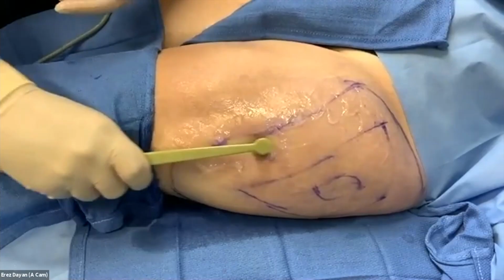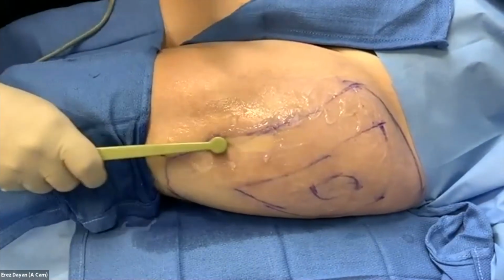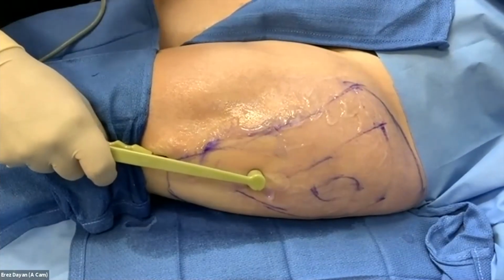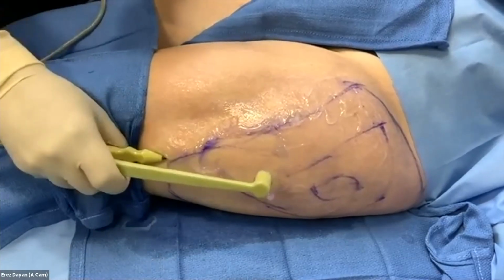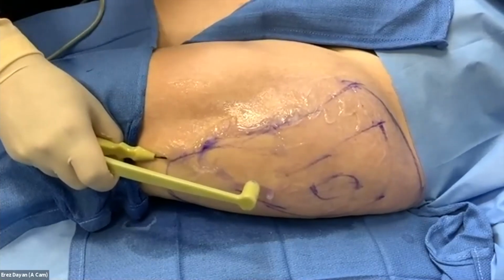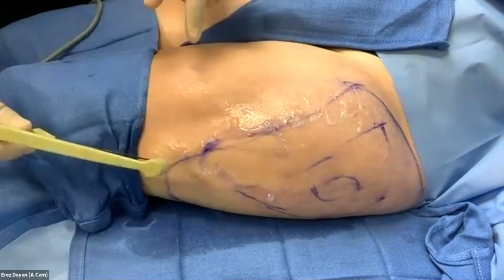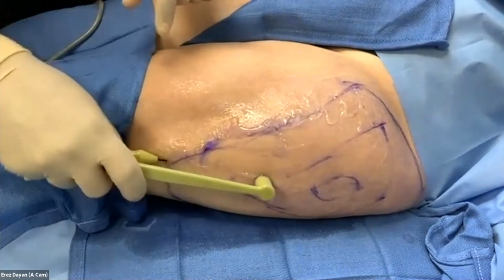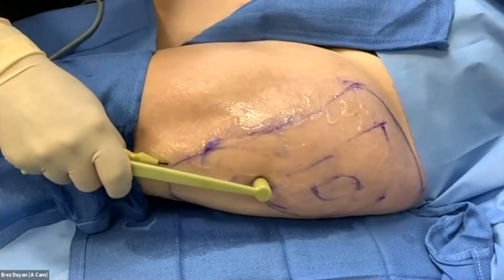Did you overdo it? Well, that's a good point, and I'll show you on the second PowerPoint. Now you hear this beeping, that means I've reached external target temperature. There. Now, a couple important safety considerations here. One thing you want to do is always be cognizant of where the internal cannula is. So I never cantilever up. I never want to see kind of the internal cannula under the skin, then you're too superficial. You're heating right at where this metal part is here, so it's a coated tip. So you really want to make sure deep is safe. So you want to make sure you're deep. You want to make sure you're cantilevering the device down. That's the major safety consideration.